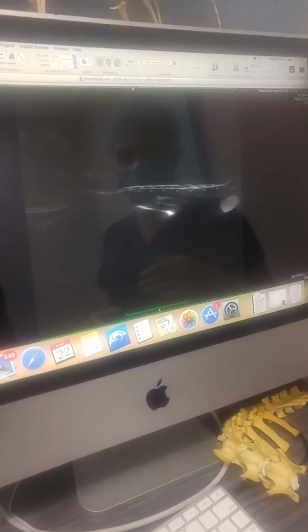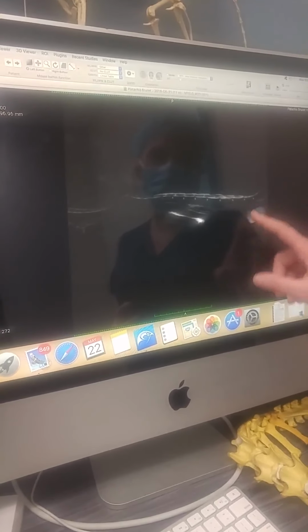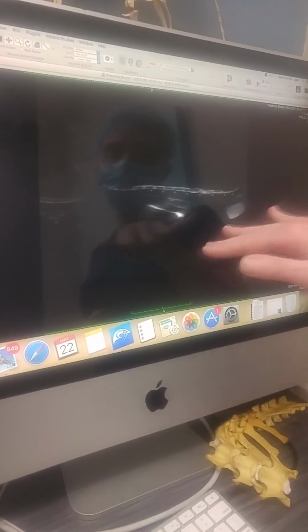When we look at a spine, we always want to look at it in different angles and multiple slices, okay? This image only looks at fluid flow along the spine and in the body. So that tiny piece there, that's the bladder, and it's normal to be very white and round because it's filled with urine. And right now we're looking basically at Pistachio from the side.